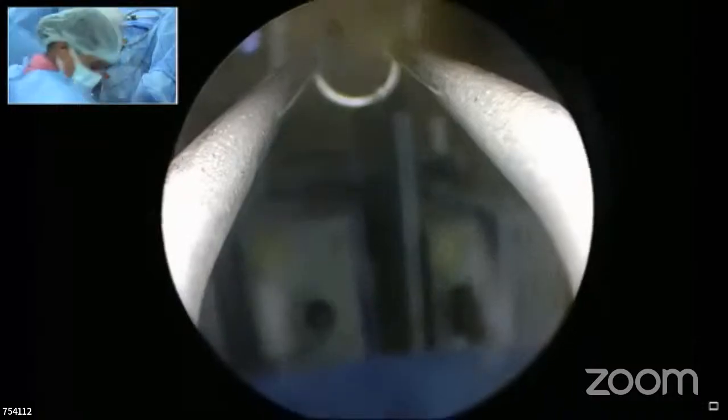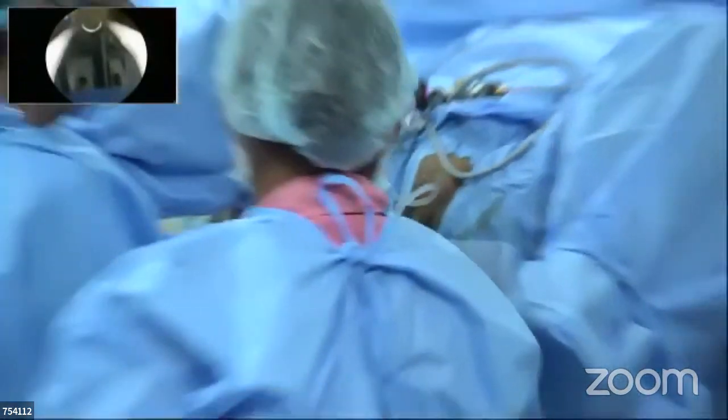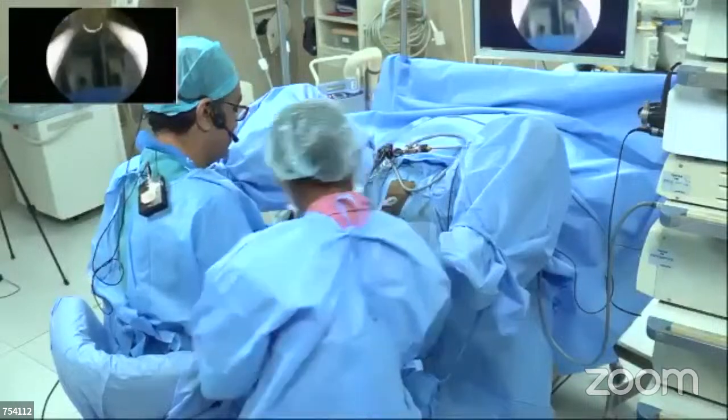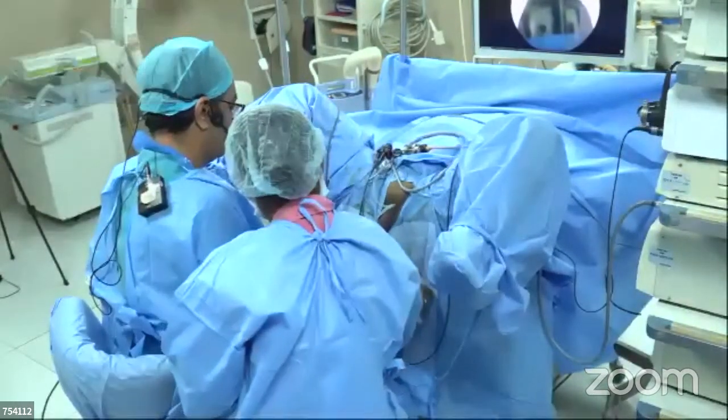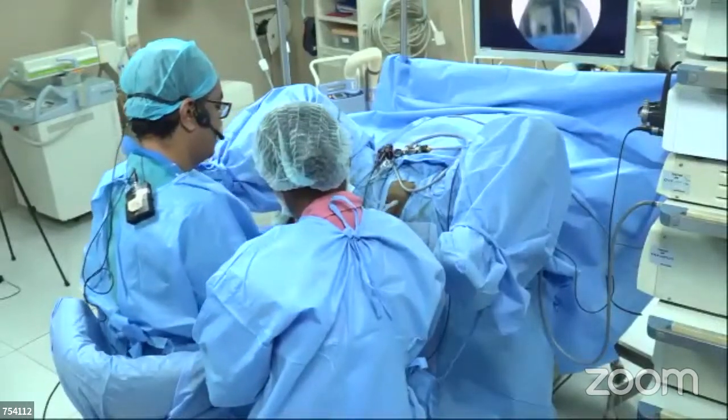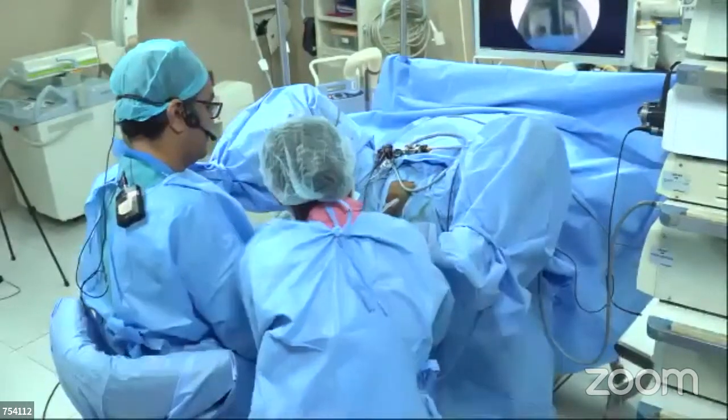Sometimes prostates also help, sir. Oh, definitely. Of course, our technique helps and sometimes prostates also help. No, sometimes even small prostates can bleed badly. Hardly. He has a very friendly prostate to do. No, but he has got control of the main arteries initially itself. Yeah.